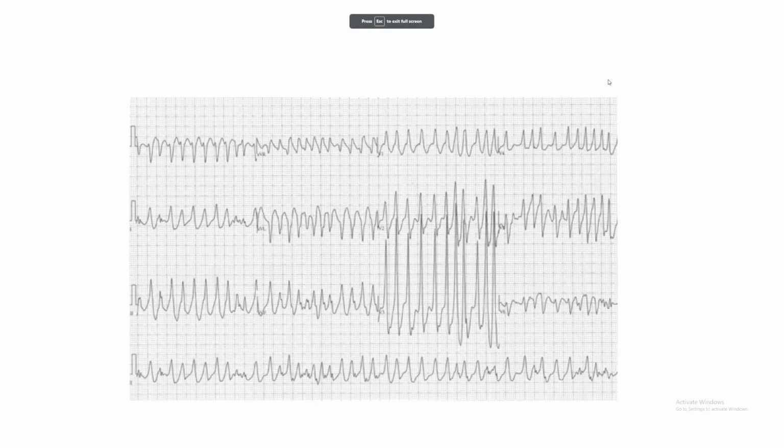All right, so this is our EKG example of WPW, and specifically this is antidromic WPW, and we can tell it's antidromic WPW by two characteristics here. So we have our delta wave going into our QRS, delta wave, and our wide QRS. And then let's take a look at our rate. Our rate is about 290, 300 beats a minute, something within that range, right? So this person's heart is definitely not happy at all, right? So what are we going to do when we treat this patient?